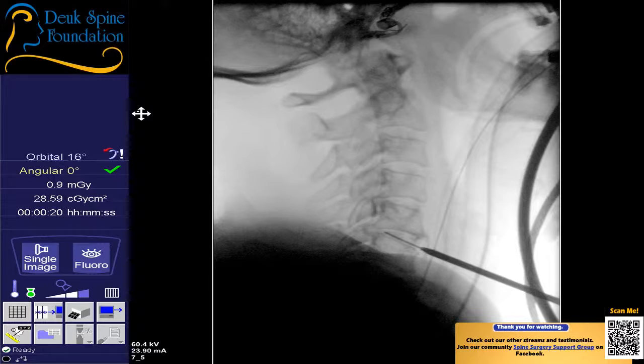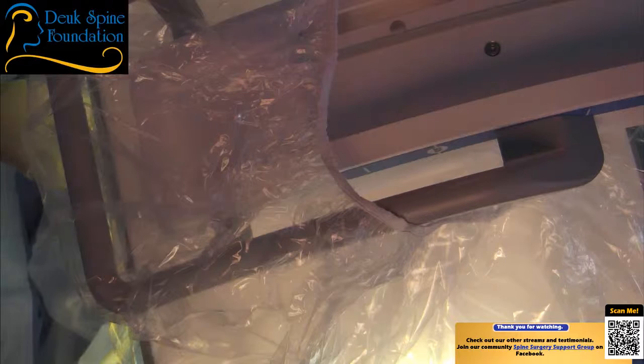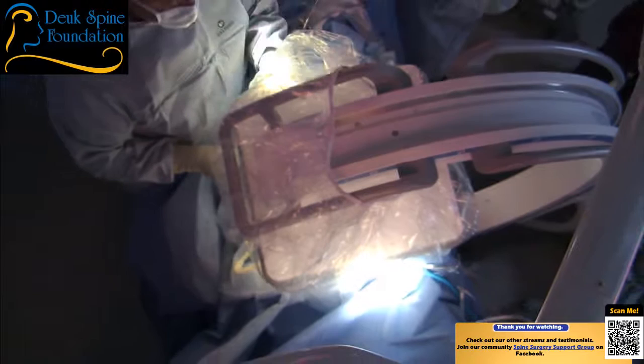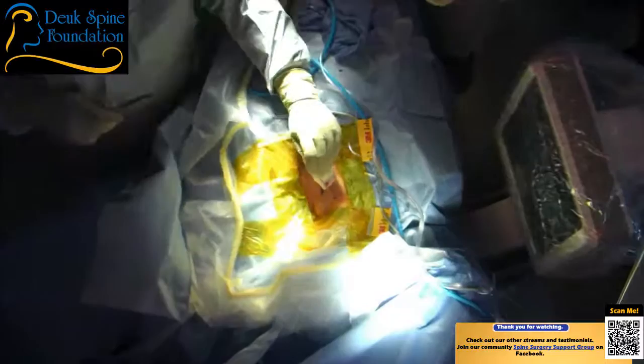We're going to get another view through the front to make sure we're close to the midline. You don't have to be exactly on the midline, but you want to be within a few millimeters. Can we straighten her head out? It's cocked a little bit to the left towards me. You see that tip of the dilator, then the guide wire down there in the middle? And there's a spinous process just below. We are really just where we want to be.